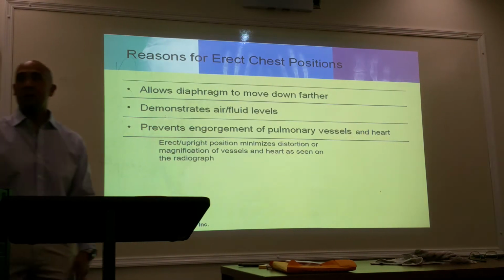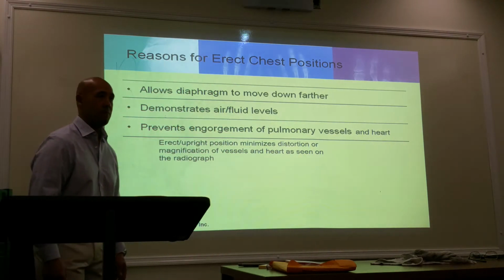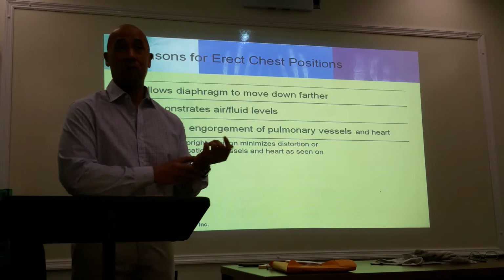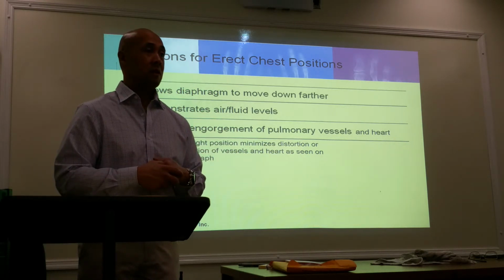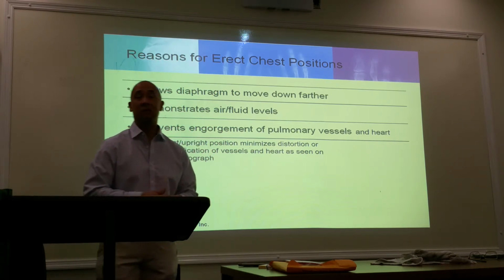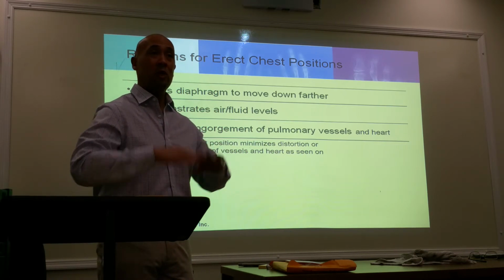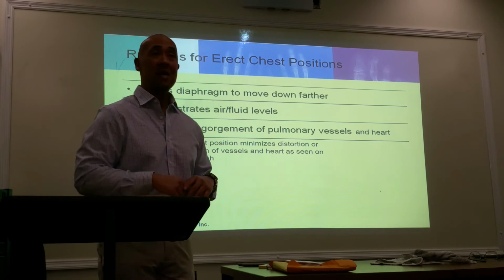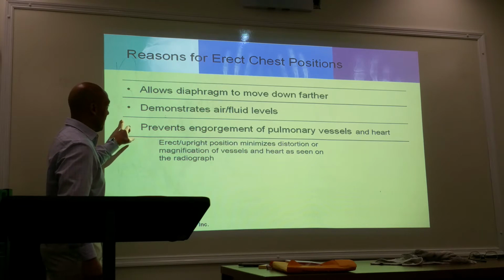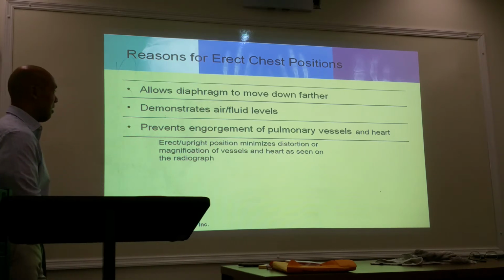Reasons why we do chest x-rays in an upright position. The whole purpose of doing it in an upright position is we're trying to evaluate for air and fluid levels. Also, if you're sitting up or standing up, what happens to your diaphragm? It goes down, which will allow for more air intake when you're doing inspiration. So the diaphragm moves down further. It is to demonstrate air and fluid levels. And then it prevents engorgement of pulmonary vessels and heart.